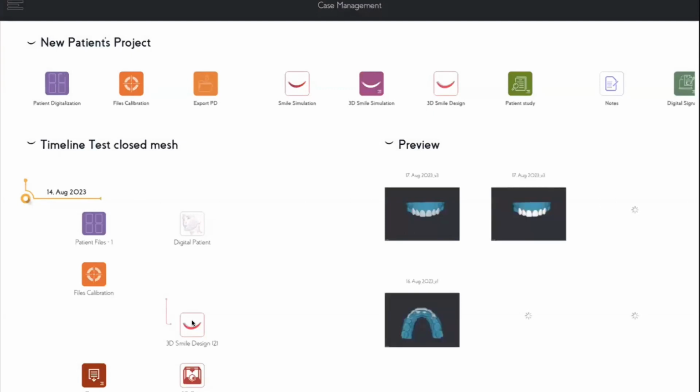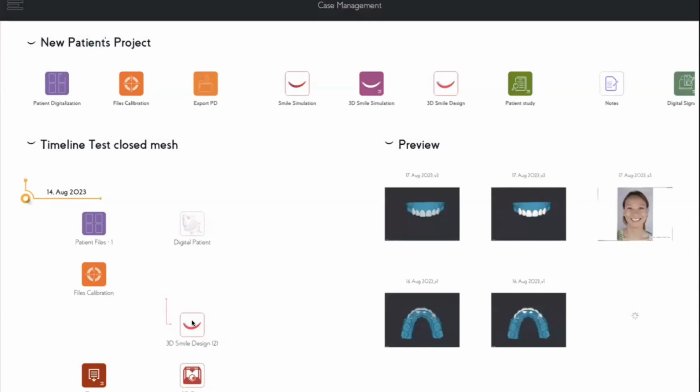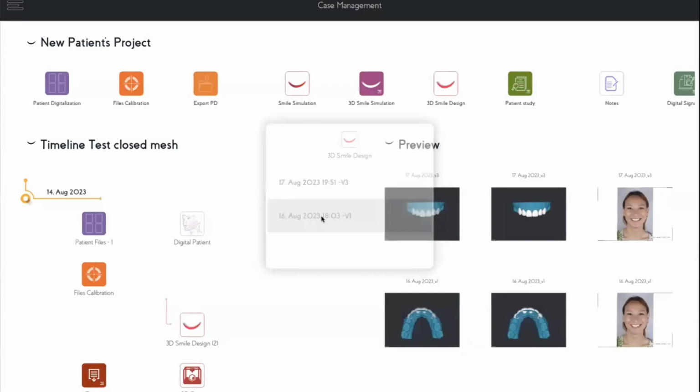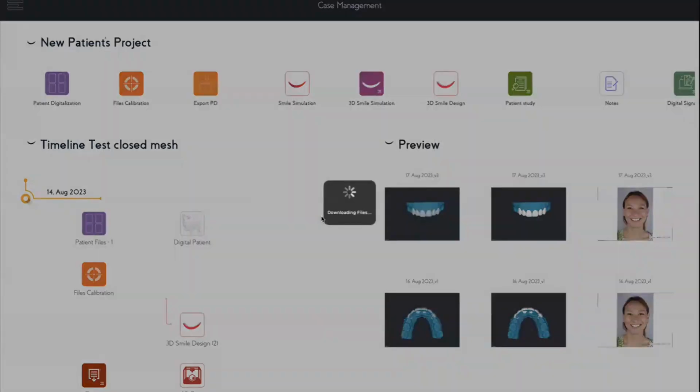Also a very, very interesting and unique technology. And I think you will understand when I show you how easy it is to use, then it's going to make more sense for us to discuss all this.